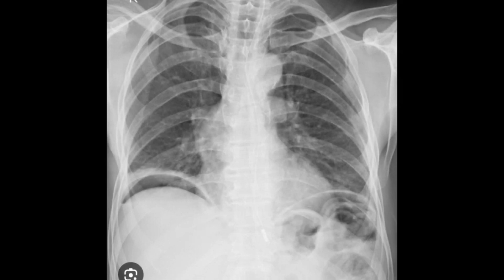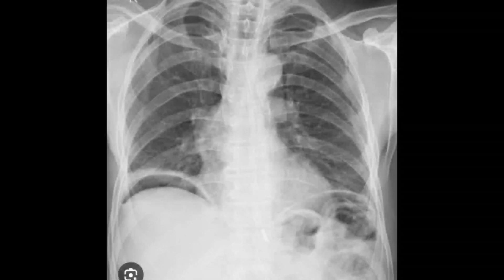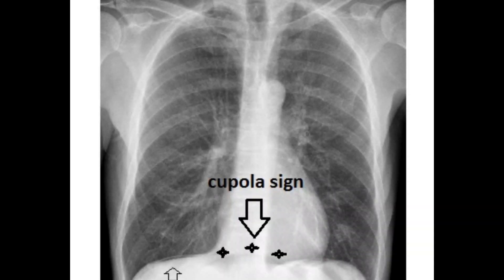Pneumoperitoneum can also be detected on the chest radiograph. A specific confirmatory sign is gas underneath the diaphragm. The cupola sign can also be appreciated — this is air arising within the abdominal cavity of supine patients that accumulates underneath the central tendon of the diaphragm in the midline, where the superior border is well-defined but the inferior margin is not.